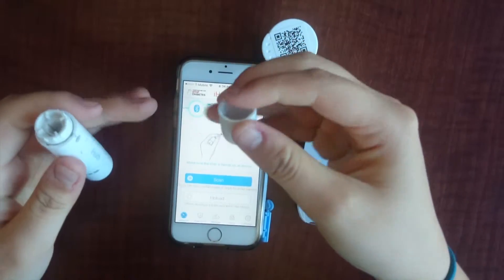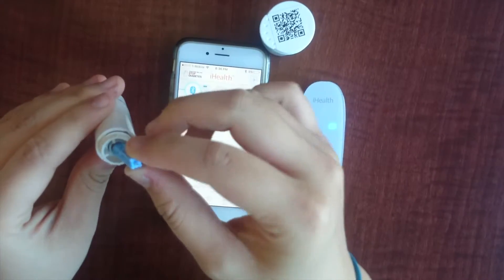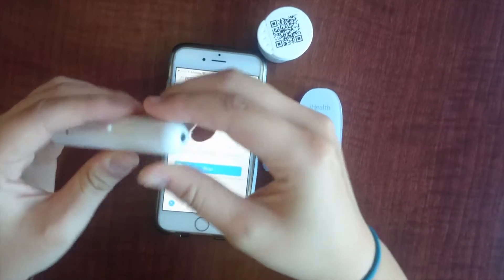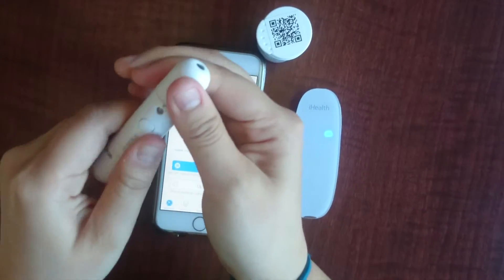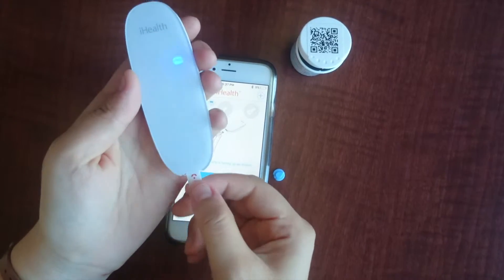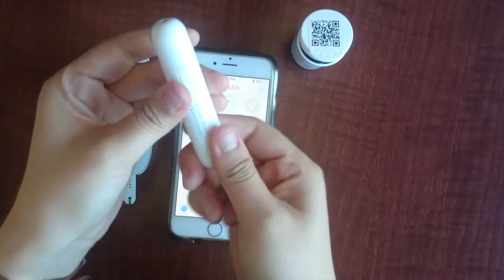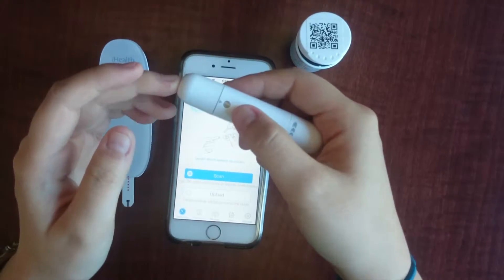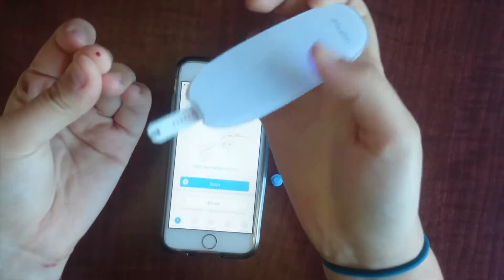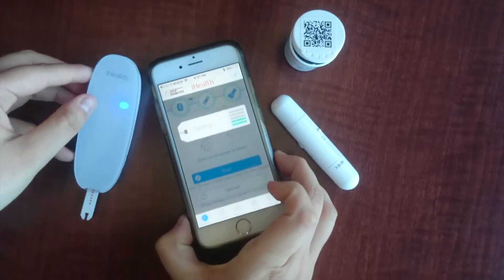We will now see what happens when we obtain a blood sample and have the glucometer read it. Here we have the lancet, and I am going to place it in the lancing device. Once it is firmly secured, just put the top back on. You can then twist it to set the level that you want the lancet to pop out at. We will then insert an iHealth Glucose Test Strip into the port and obtain the necessary blood sample. Just twist the bottom and press a button, then place your finger against the test strip and the device will read the glucose levels.